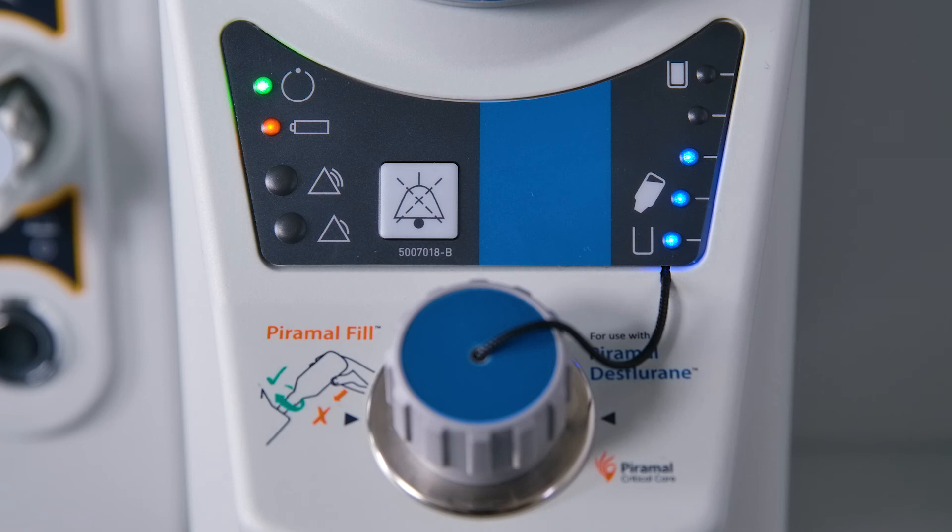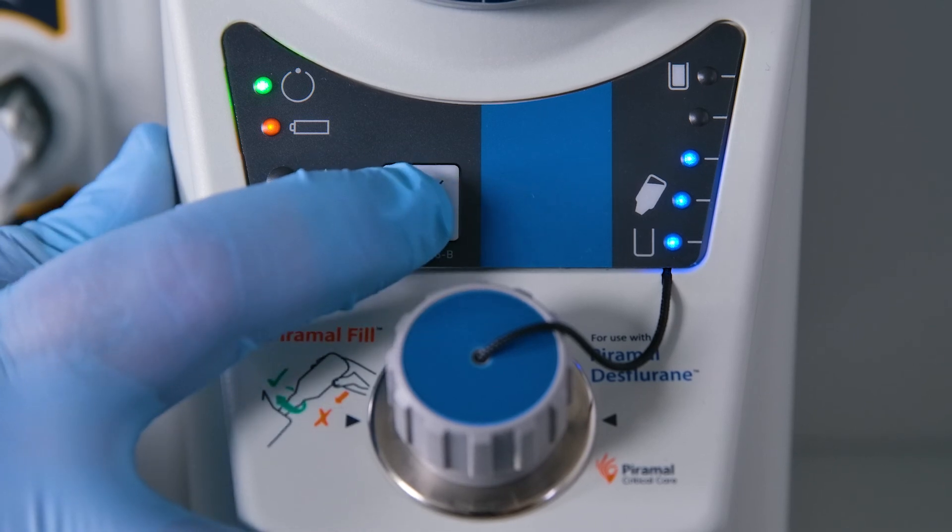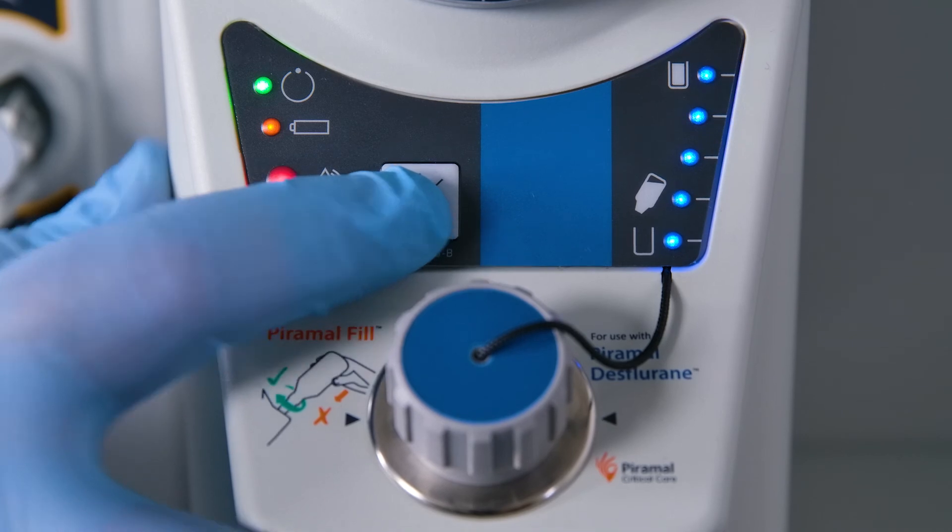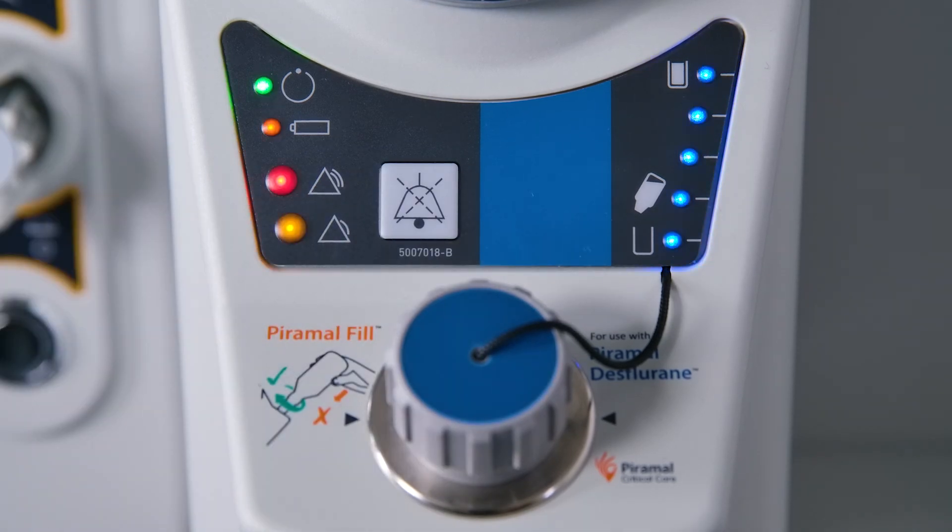Initiating a vaporizer self-test. With the vaporizer in standby mode, the user can initiate a brief self-test sequence. Press and hold the mute control for 5 seconds to initiate a vaporizer self-test. All indicators will flash and the audio sounder operates during the test sequence. The vaporizer will return to standby mode when the self-test is complete.